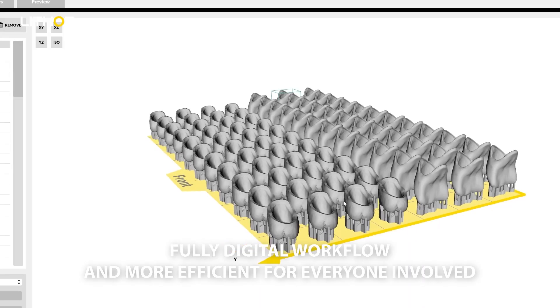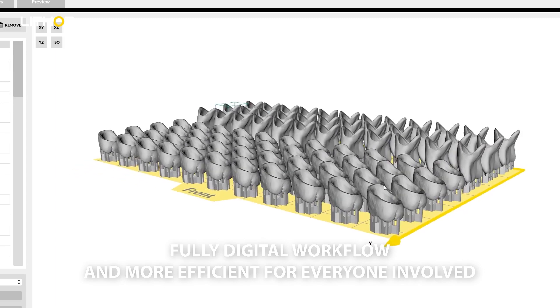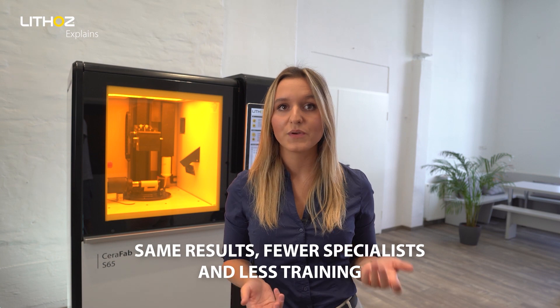A fully digital workflow simplifies the entire process and makes it far more efficient for everyone involved. While traditional veneer production is a very specialized process, 3D printing is in comparison a far more accessible technology which offers the same results but requires far less specialist experience and training.